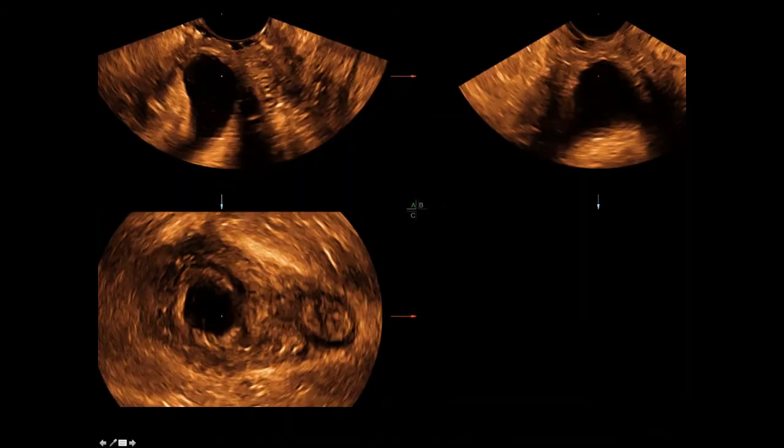So this is a 3D of such a patient showing that at the level where the bladder should be well away, well up in this area here, it has descended to within about 1 centimeter from the vaginal probe on the introitus. And in this 3D view, you can see I've put the dot on the descended bladder, and you can see it in all 3 views, so that if you try to do a pelvic floor where you would have seen the urethra, the vagina, and the rectum, what you see is the bladder.